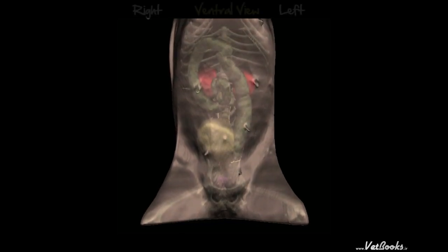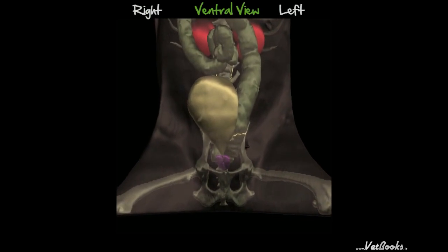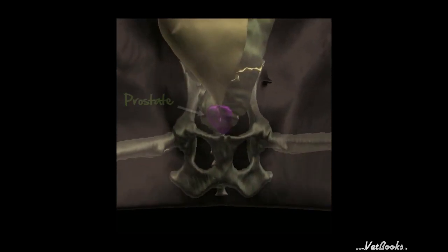Much like the scrotum and testicles, which can be easily evaluated with ultrasound, the prostate is generally accessible transabdominally, at least in part. A transrectal probe can also be used to complete the exam, especially if the prostate extends more deeply into the pelvic canal, or if a mass or cyst that extends into that canal is suspected. If the bladder is fully distended, the prostate will likely be pulled cranially, facilitating the examination.